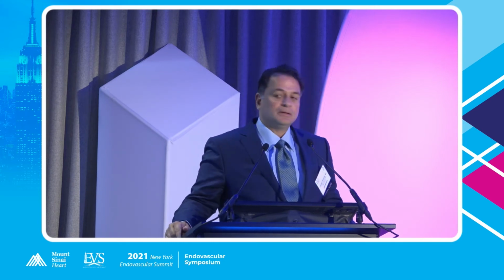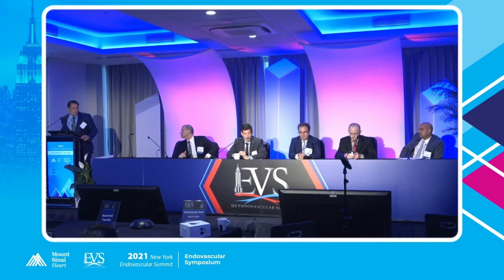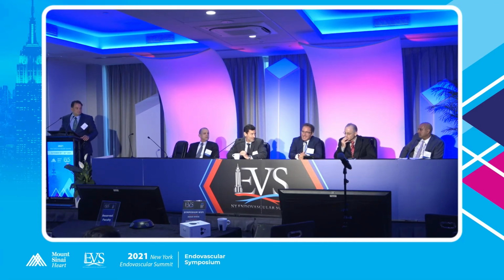When do you use cutting balloons? Okay, so there's a good question here for anybody. Maybe Dr. Bianchi, when do you use cutting balloon? Not primarily. I think for restenosis, probably. Early restenosis particularly, hyperplasia, but not for native disease. I like to use it for non-dilatable lesions that have low amounts of calcium in them because the balloon's easily ruptured. So I think that's its niche.